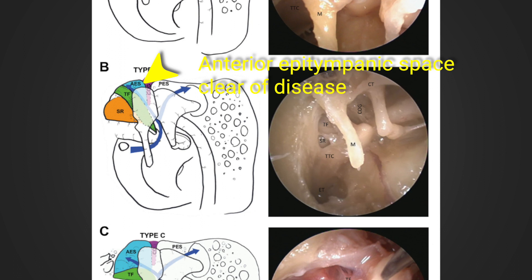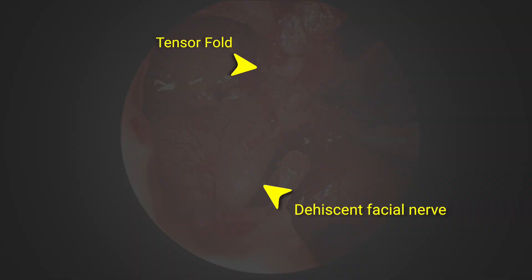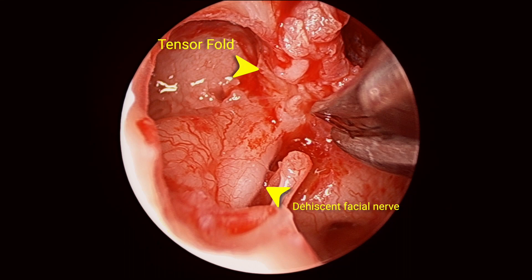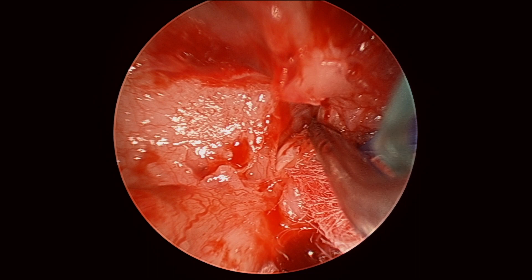The disease is clear above the tensor fold, but the super tubal recess has the bulk of the disease in this example. So we're dividing the tensor tendon here, and the tensor fold can be seen above with the dehiscent facial nerve. Various instruments are used to clear the super tubal recess, including short, medium, and long Thomassin instruments, and a round knife was used in front of the tensor tendon to clear the disease.